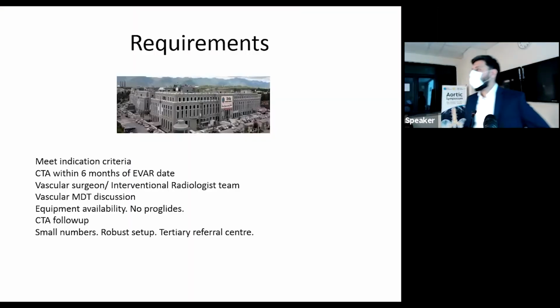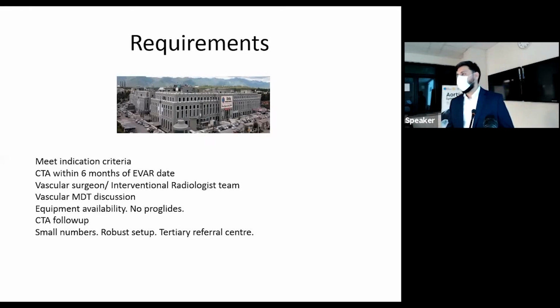So before we say anything else about endovascular aneurysm repair, the main thing is that you need a team, you need the support, you need that environment where you can provide the service.